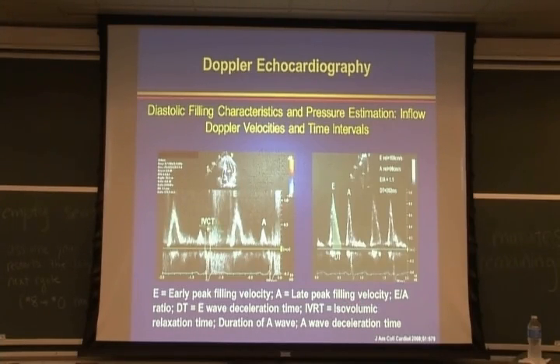We can also measure how fast the velocity comes down, and we can measure deceleration time from the peak, which gives an idea about the myocardial stiffness. So that can also be measured in a very precise way.